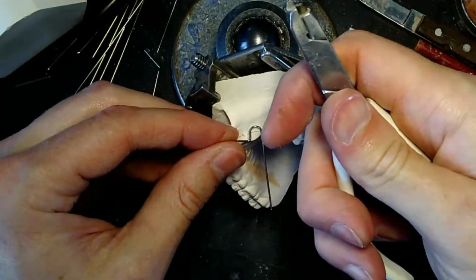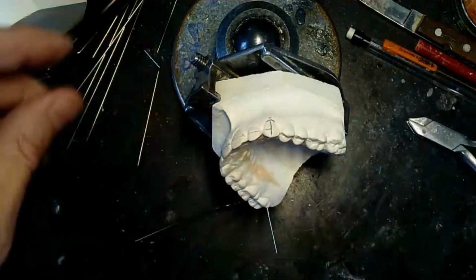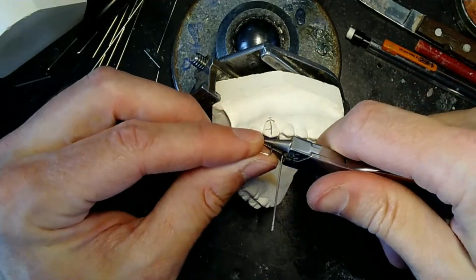So I'm actually using this loop former. I usually use this one because I usually don't like loops being this tall. I don't think doctors do either, but hey, this is what they ask for in the exam, so you better do it.